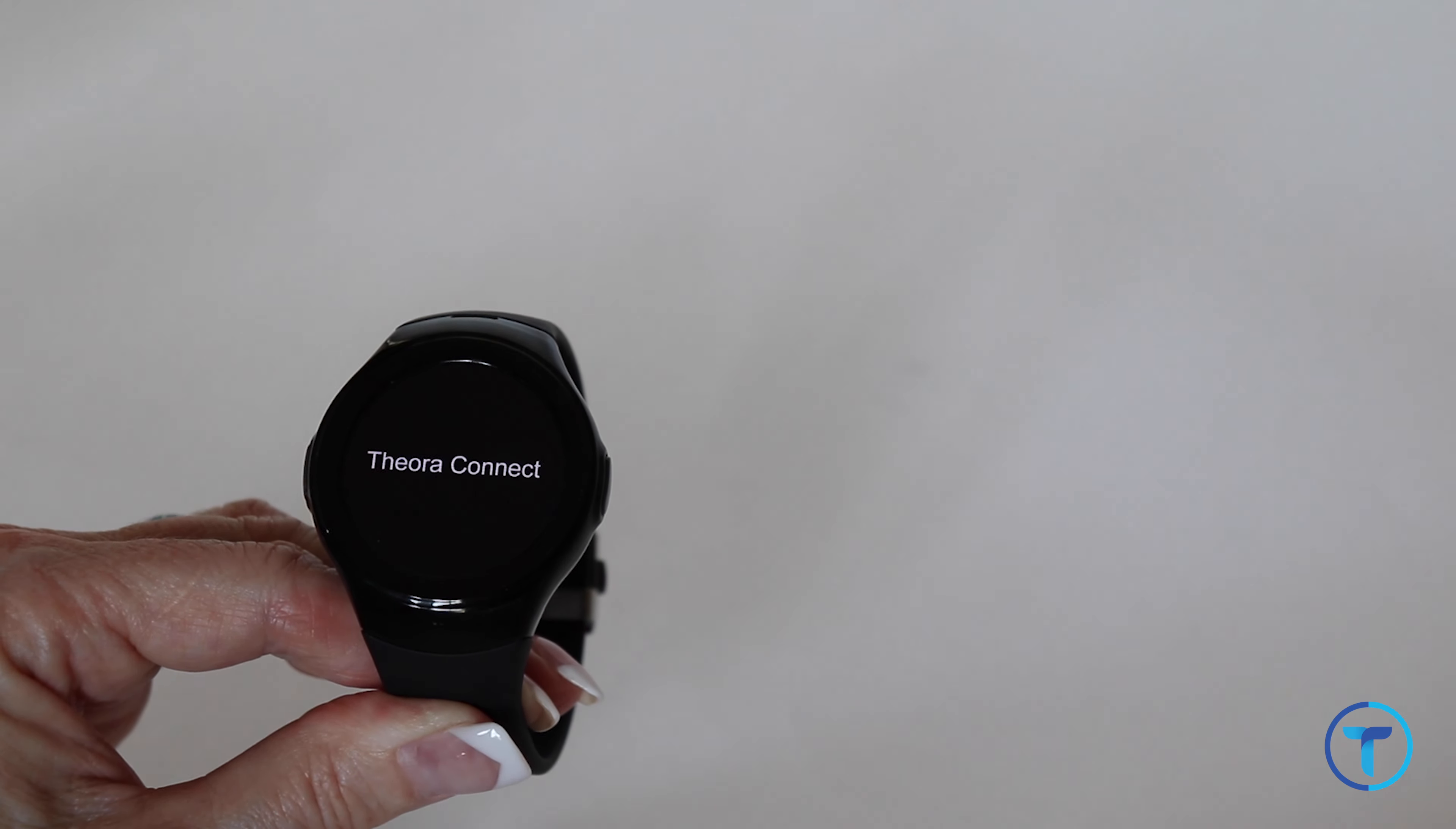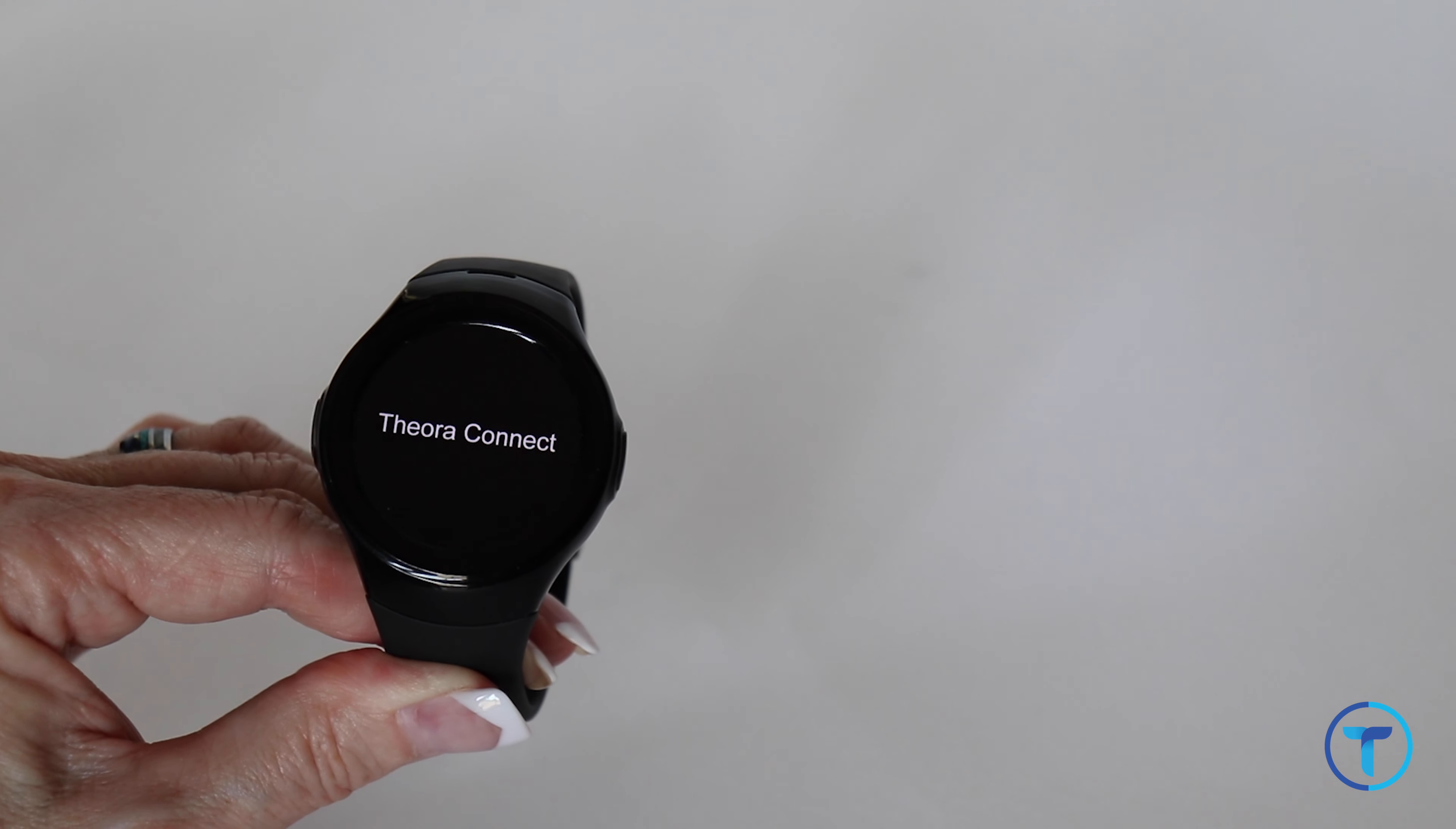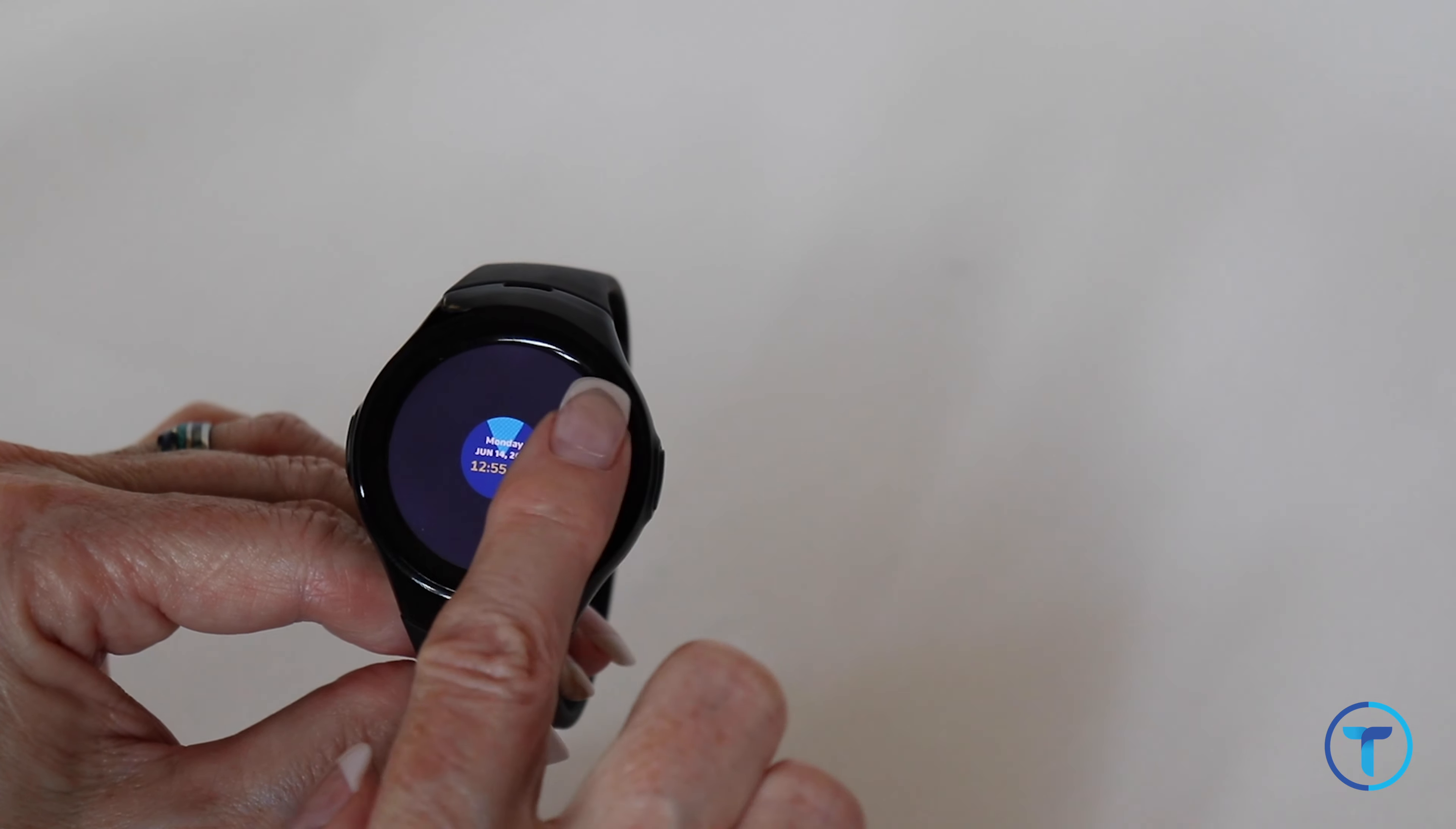When it reboots, in order to get out of lockdown mode, you have to quickly go back into user settings. There's about a 60 second window for this, and turn lockdown mode off. This has to be done following the watch rebooting itself.